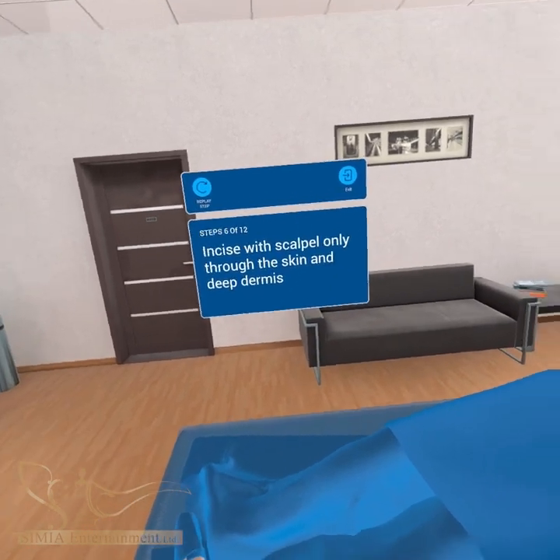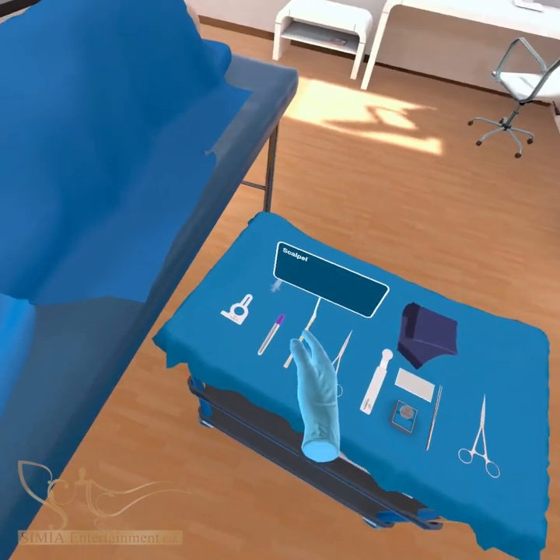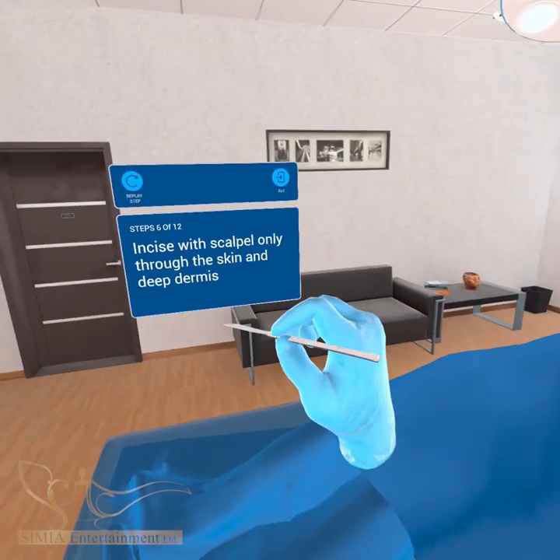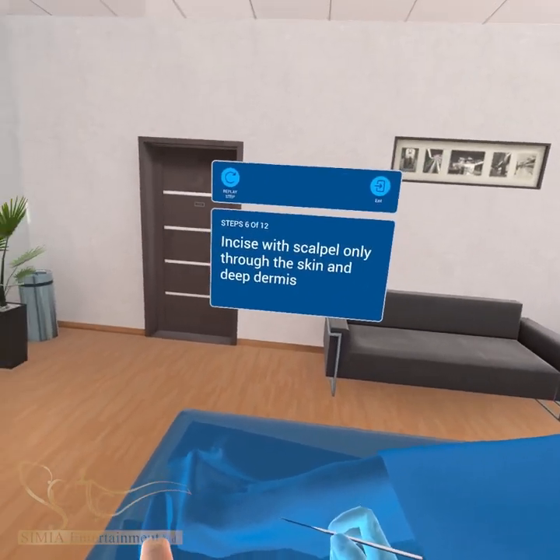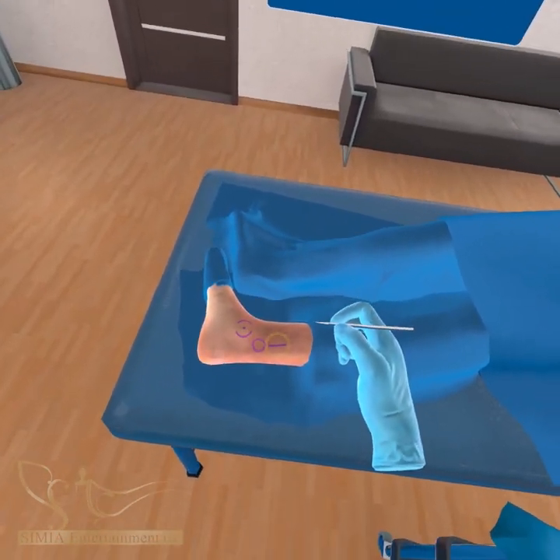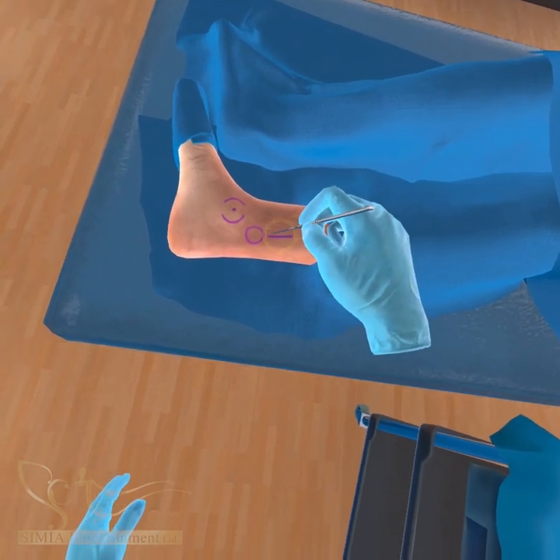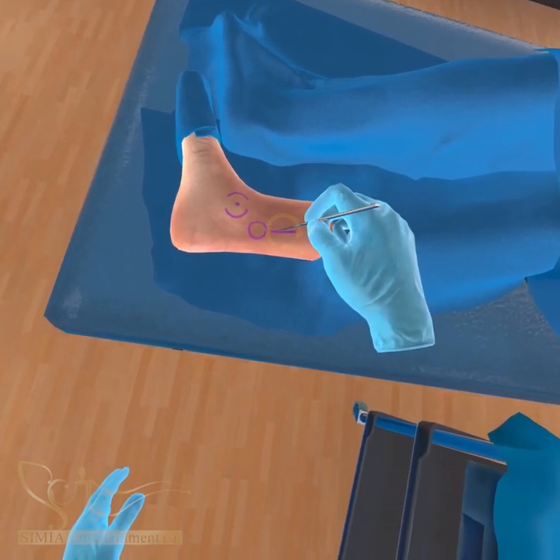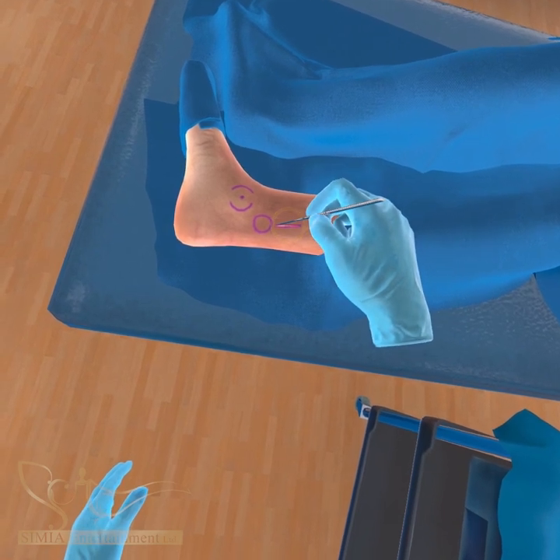After verifying the patient feels only pressure and no pain, with forceps pinching along the incision and planned implant location, gently use the scalpel to incise the previously marked line only through the skin and deep dermis. Be cautious not to dissect the subcutaneous fat with the scalpel, given the depth to the fascia is variable between patients.